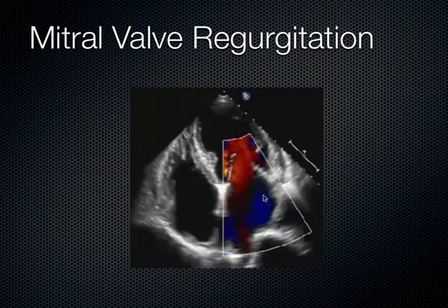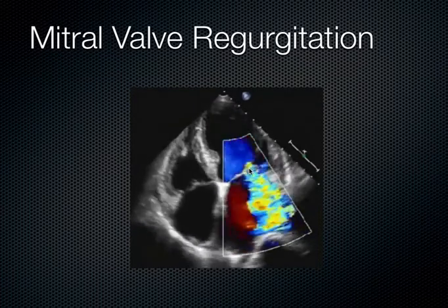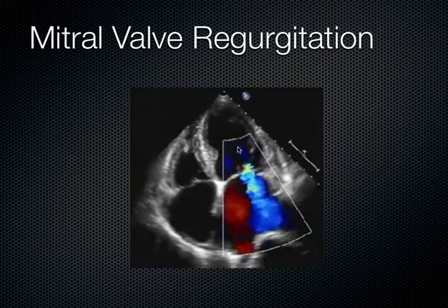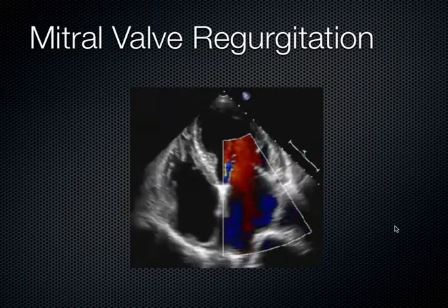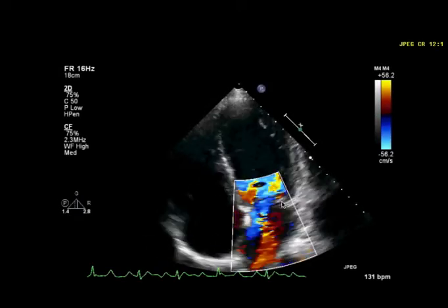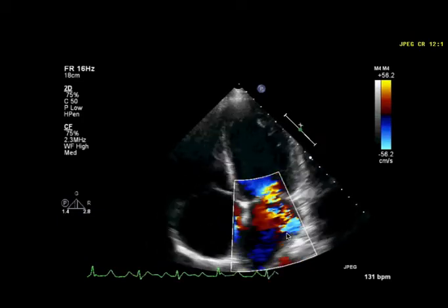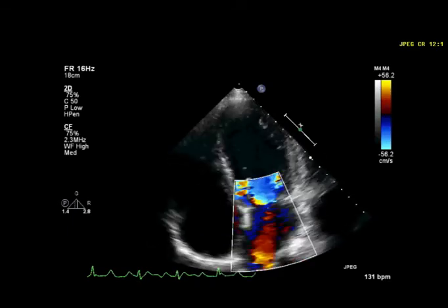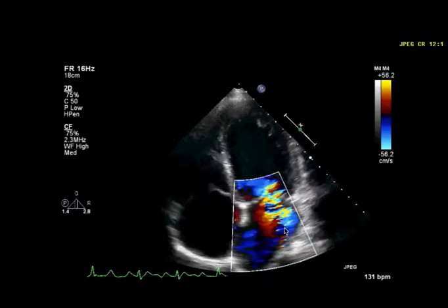See, during diastole, we see the red come right up into that ventricle, which is what we expect. But then during systole, we see all this blue away right through that valve. And that's severe mitral regurg when you see that. So put it another way, we see another blue jet on this other heart squirting to the back wall, and that's not good. That's not supposed to happen. That valve is incompetent, and we have a lot of blue away happening right there.